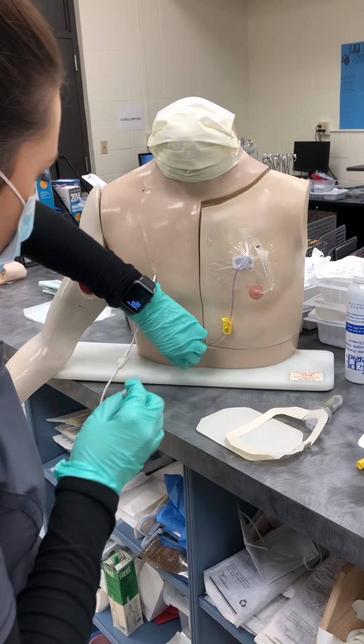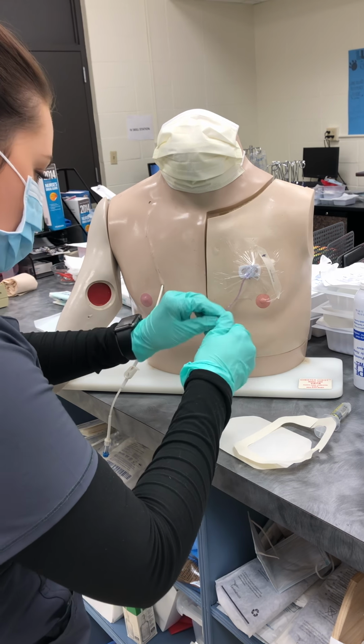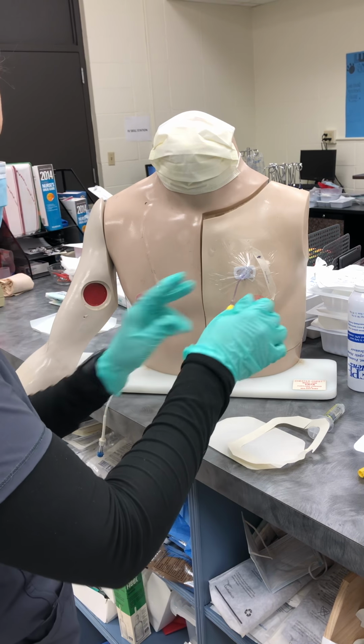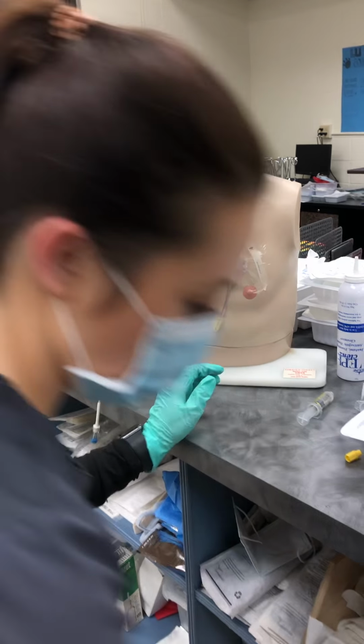And I'm going to put my cap back on my catheter, and that is that portion of that.